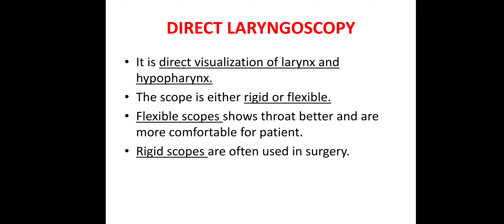Direct laryngoscopy is direct visualization of the larynx and hypopharynx. The scope is either rigid or flexible. Flexible scope shows the throat better and is more comfortable for the patient. Rigid scopes are often used in surgery.